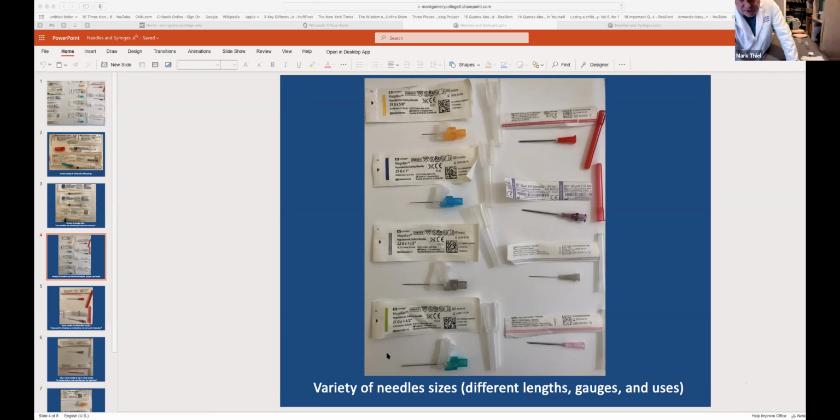All, by the way, just repeating myself, intramuscular choices. Now, this particular size, I think you know, obviously, that this wouldn't penetrate deeply enough into an intramuscular site. It can be used for subcutaneous injections in the adult because it's so tiny, or intramuscular in only infants. The tiny gauge needle, 25 gauge. It's up there in number, so the needle is tiny.